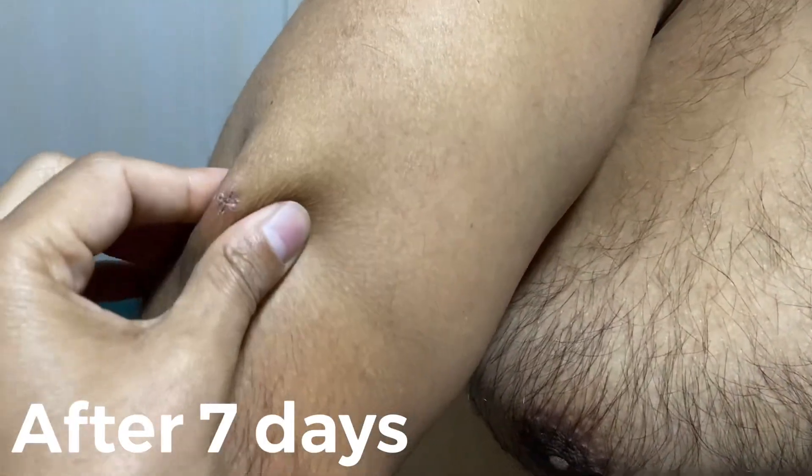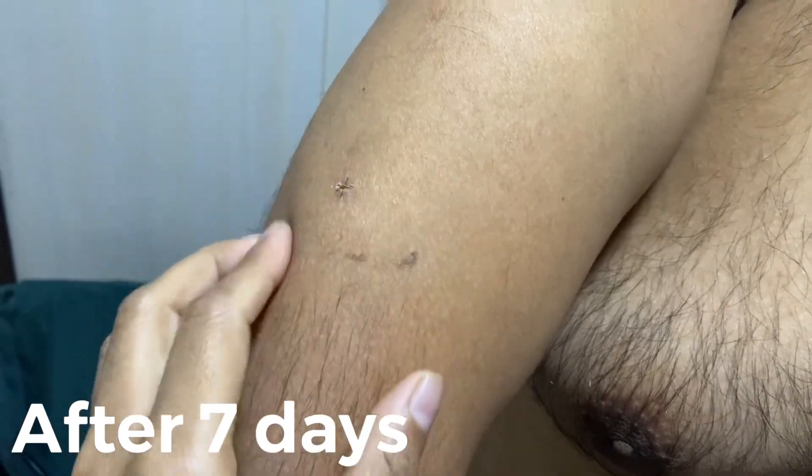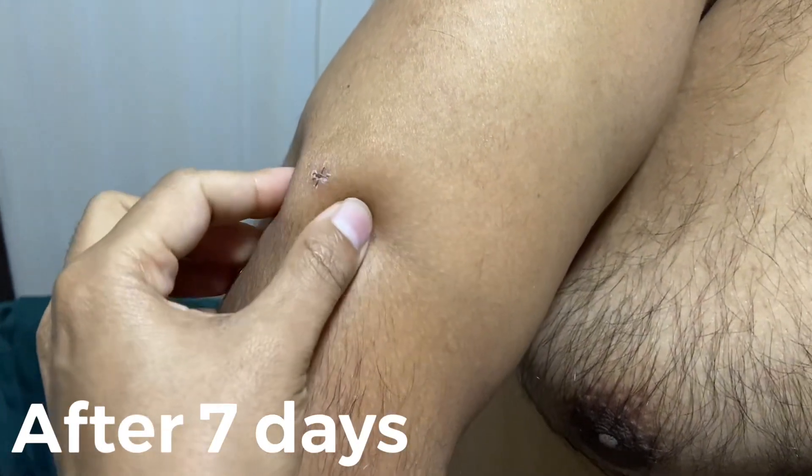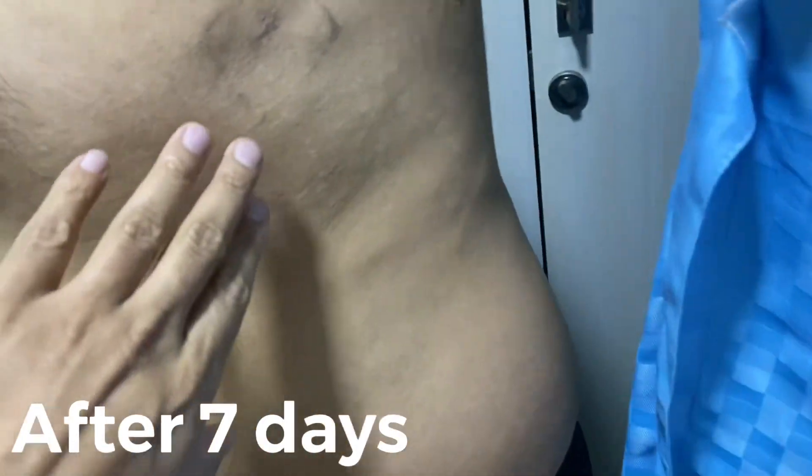Lipoma is removed. And then this one, this one — this is the only incision. This will be completely clear. These are our lipomas. Multiple lipomas patient that we removed with the scarless technique. Here too, and here too, there is also a lipoma.